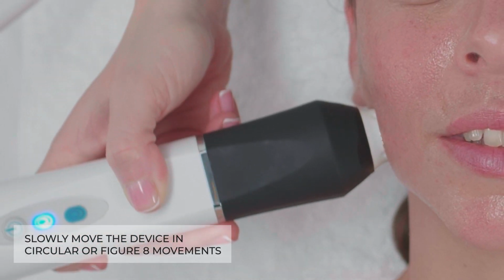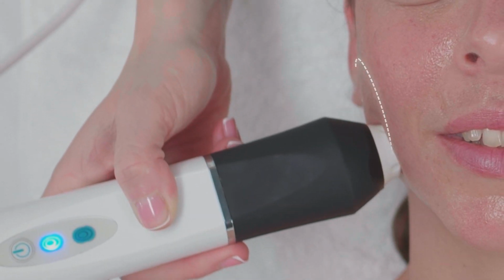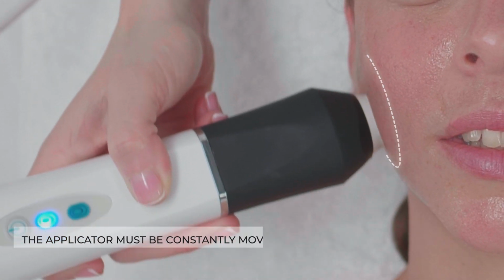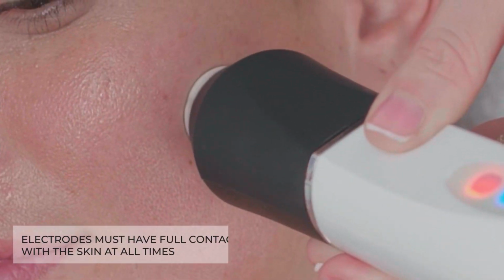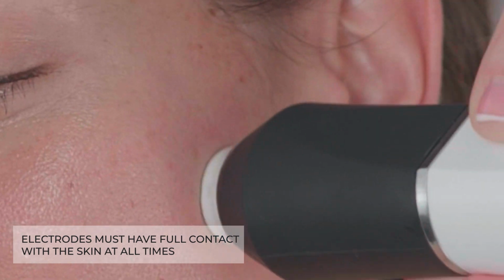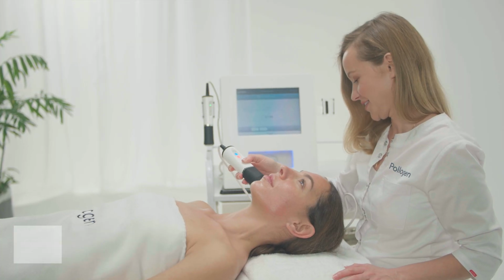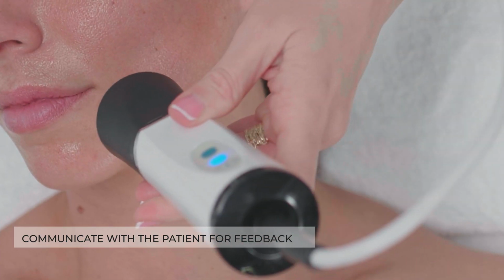Slowly move the device in circular or figure 8 movements over a small area, about twice the size of the head of the device. It is important to keep the device constantly moving and that all 4 electrodes are in contact with the skin at all times. Be sure to communicate with your patient for feedback.